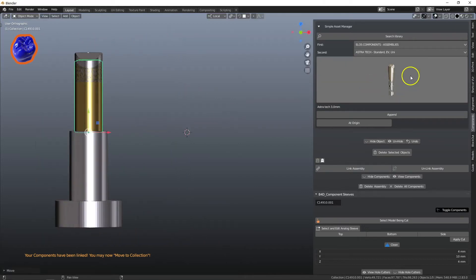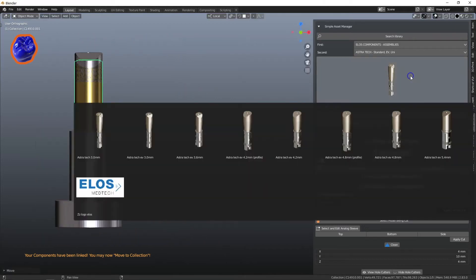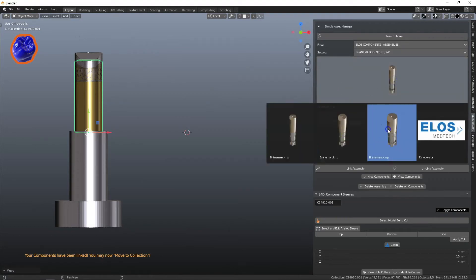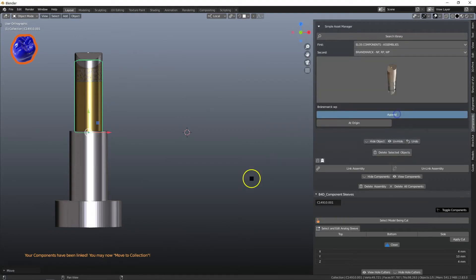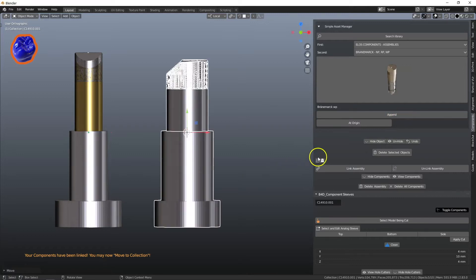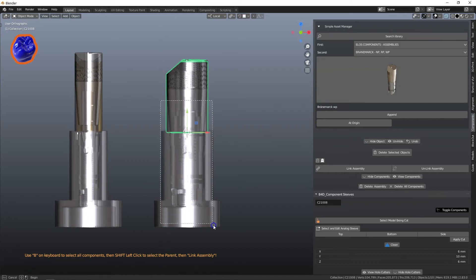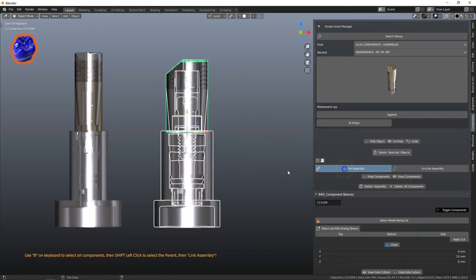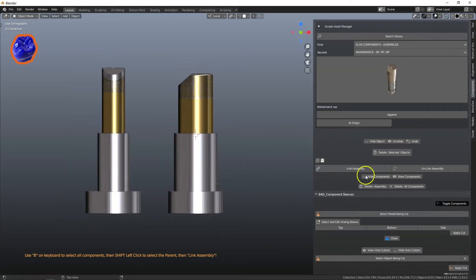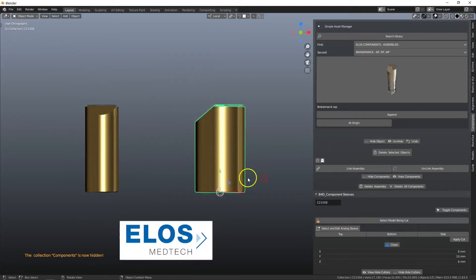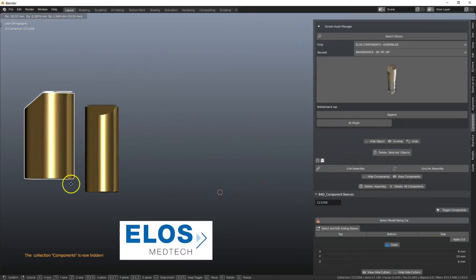Implant libraries can be imported into the 3D window by simply pressing on a thumbnail image. The tutorials will show you how to join various parts to the scan body, so the components can be safely moved around.